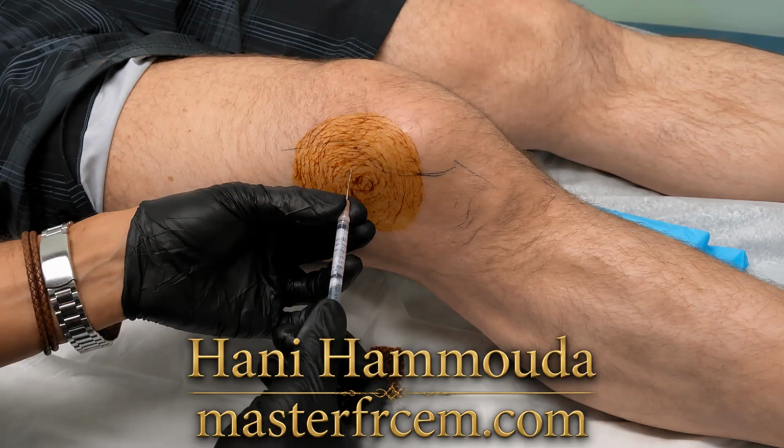Then inject the local anesthesia with a small needle into the skin and the subcutaneous tissue. Wait for about 5 minutes. Then check numbness with your forceps. After that, you want to insert the long needle and aspirate. The direction of the long needle should be posterior to the patella. You're going medial and upwards direction. Then you take fluid into the tube. Are you following? Beautiful.